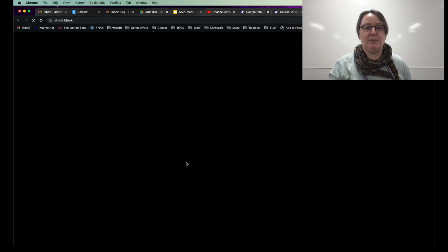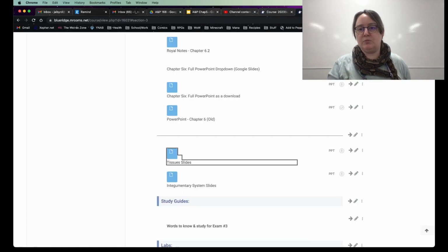So that's why I'm going to pop this open, and we're going to look at it together real quick, so that way you can see some differences between the two. And like I said, you can download this for yourself.